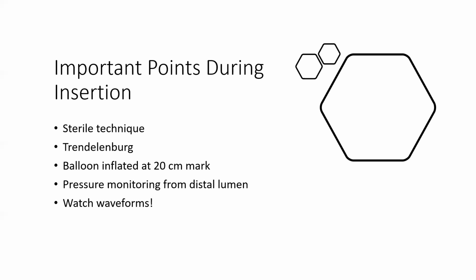All right. Sometimes we place the patient in Trendelenburg because this is going to be easier for accessing the veins, the internal jugular and subclavian veins. However, the catheter is actually easier inserted when the patient is placed flat or slightly upright. So again, the position of the patient during insertion is the preference of the cardiologist.